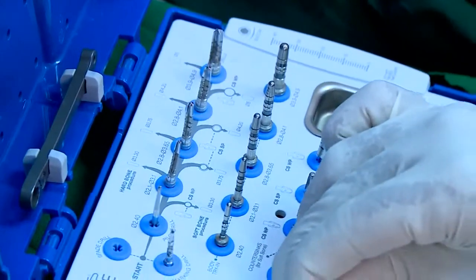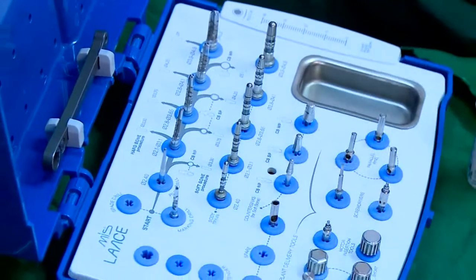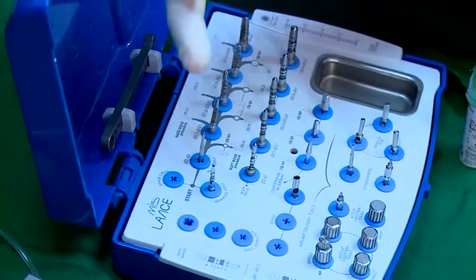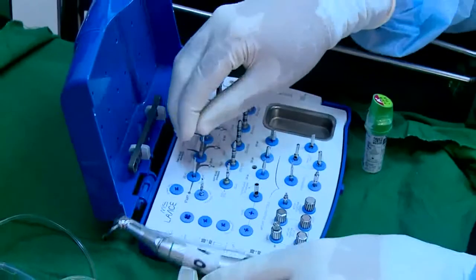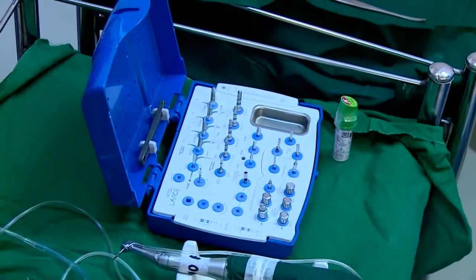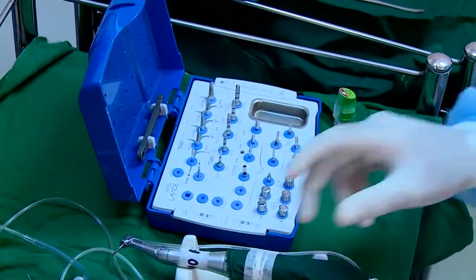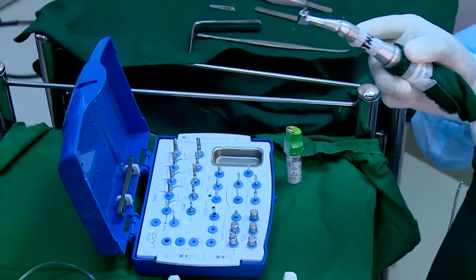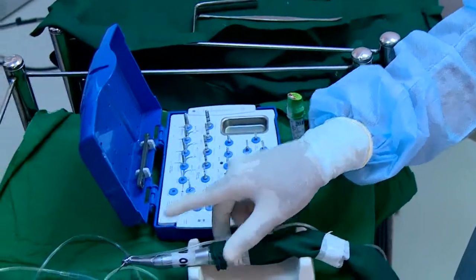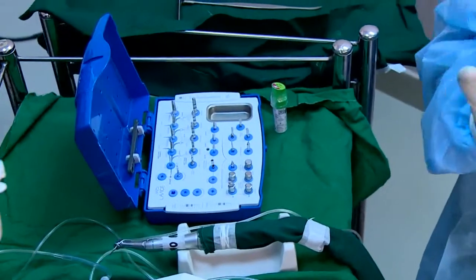Can you explain the kit in detail? Yeah, why not. As I said, the first drill we are going to use is a lancet, or many times you come up with a pilot drill. Some systems come with a lancet, which is a very sharp drill. A pilot is the one which goes in the front. If you have seen VIP convoys, those are the first, thinnest drills.